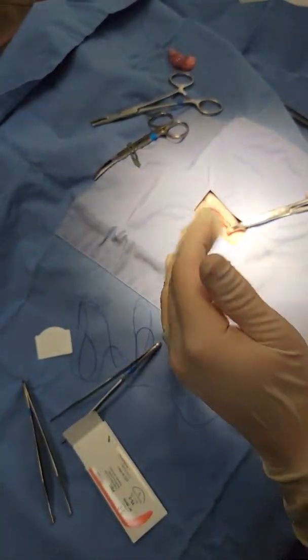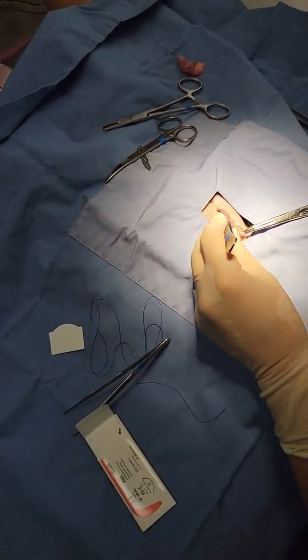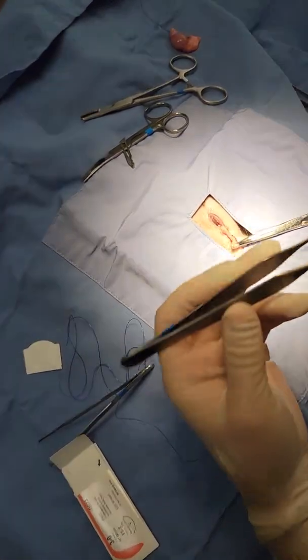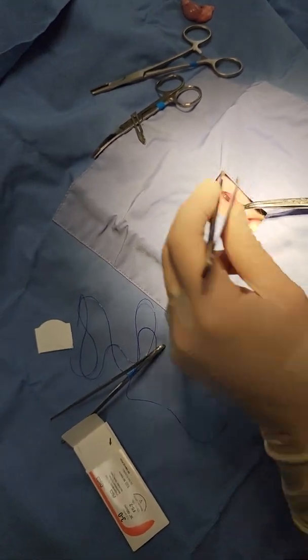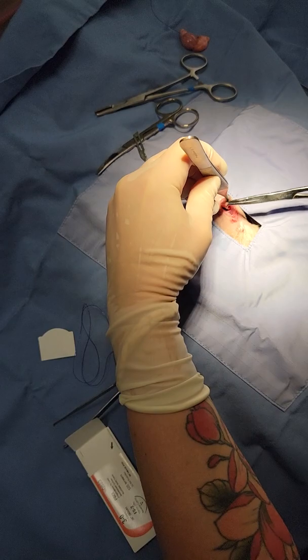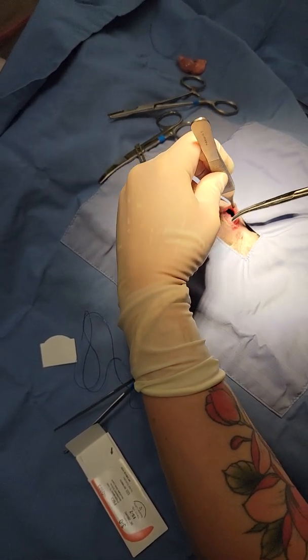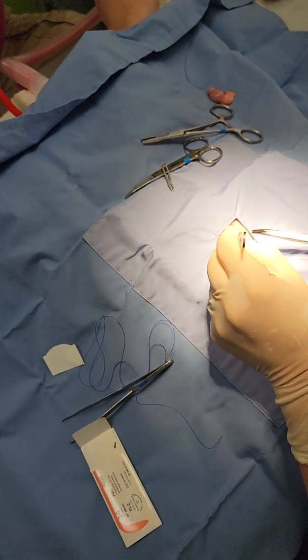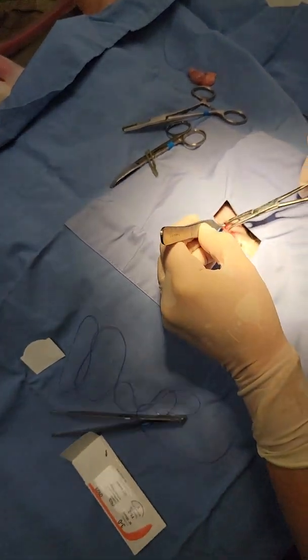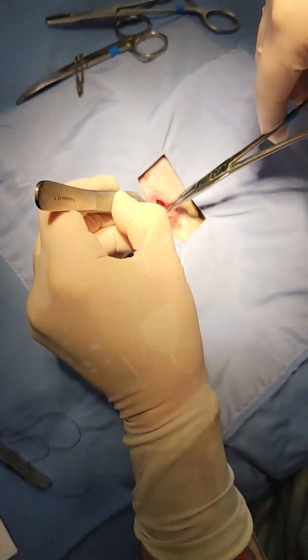Most of the cause of bleeding you have tends to be from the musculature. You'll notice right here — here's my colon hanging out. So you can see again why I'm super cautious when I make my stab incision. So taking my muscle, slipping that back in. Jason's now going to agitate the testicle on the other side — the right side of the animal. And I'm going to try to peel back the muscle so you guys can kind of see what you're looking for.